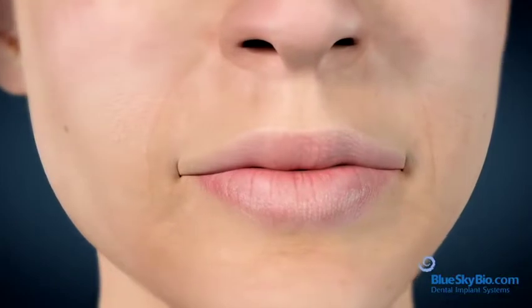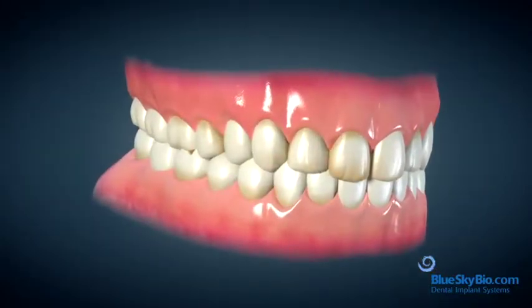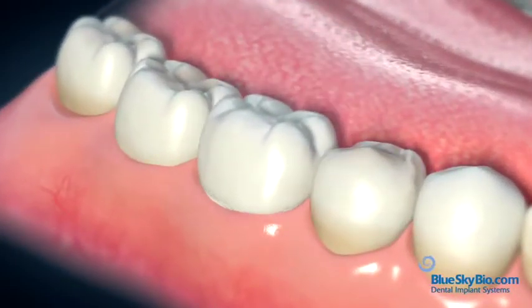As we get older, so do our teeth. Decay, trauma, fillings, or even the way we chew can make our teeth wear down as well. Placing a crown over a weakened tooth can help the tooth from breaking or wearing down even more.